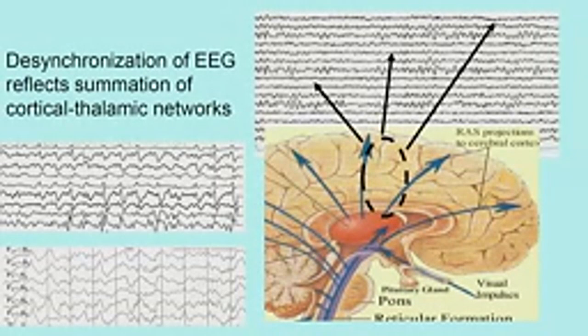And the negative patterns, or the malignant patterns of EEG that we see in patients who have survived a cardiac arrest, are low entropy states. Whereas the brain, typically when there's network function of the brain, the electrical activity that we see has high entropy. It's variable, it's reactive. Like if you stimulate the patient, there's a change in the EEG that you can measure. Whereas when there's an injury to the brain and network activity of the brain is lost, then the brain becomes much more rhythmic or periodic and less entropic and not reactive to external stimulation.